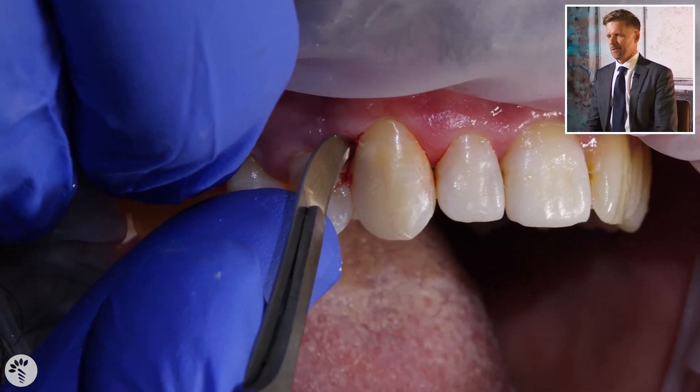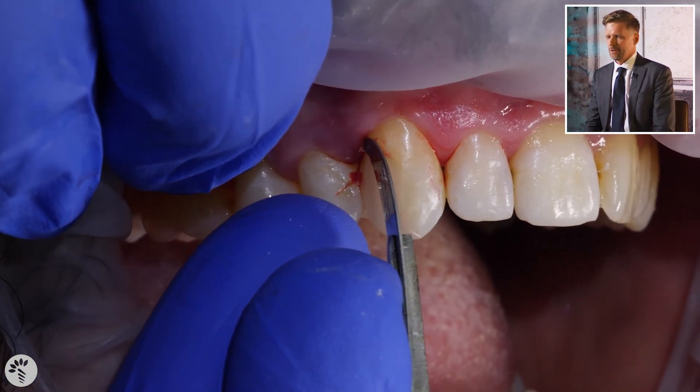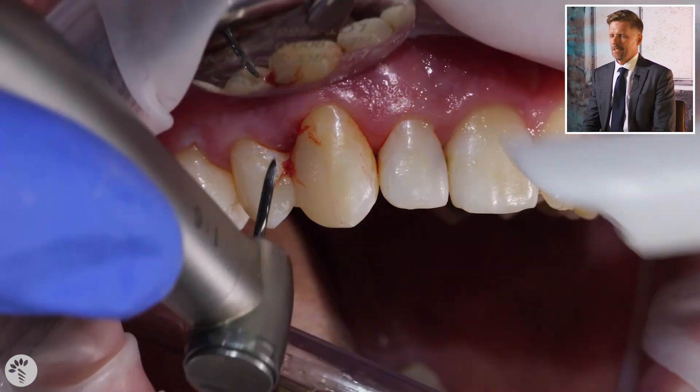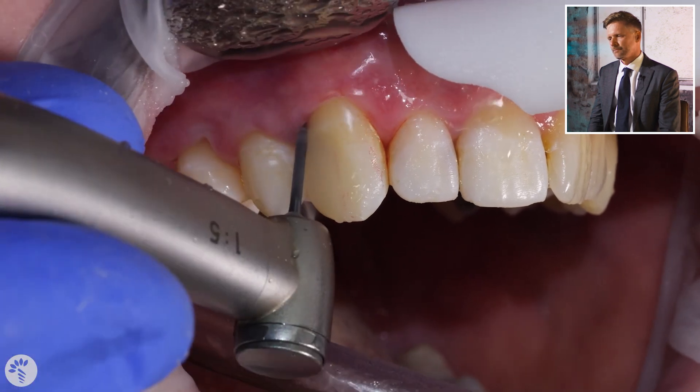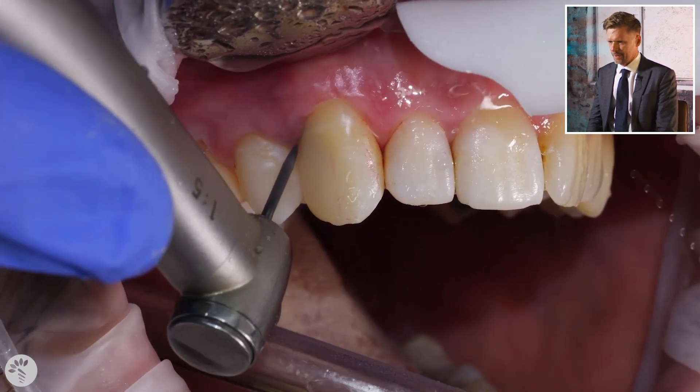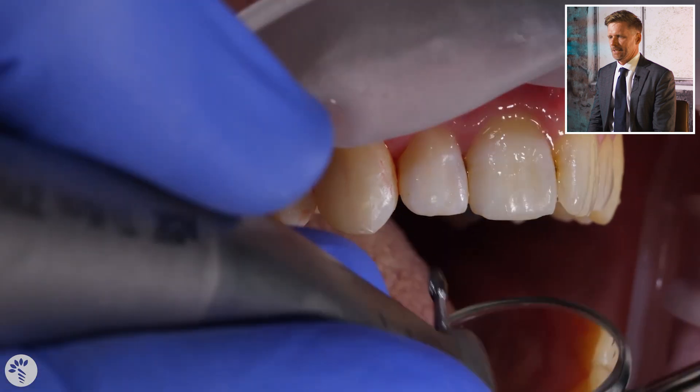Now we've done all of this, we've taken the rubber dam off and we're going to pull out that one sneaky little bit of rubber dam that tears and gets stuck in there. Do whatever you have to do to remove it, but just don't leave it there. Always get some air and blow hard in between to make sure that the area is nice and clean.